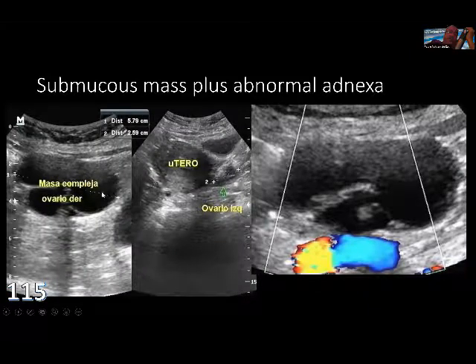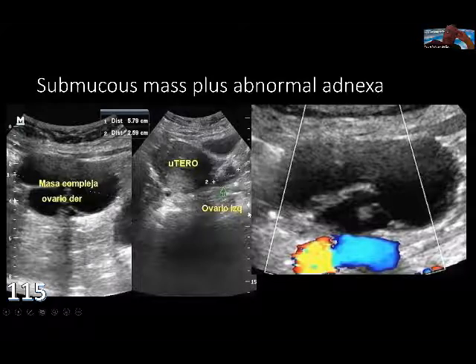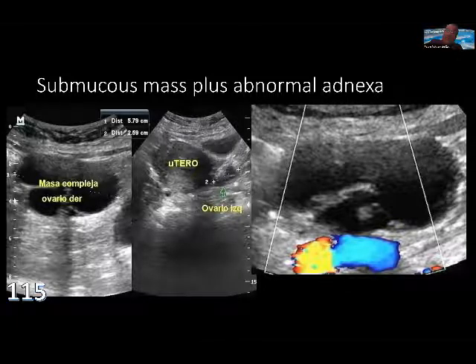And that next thing, I can call it ovarian at first sight, but see this? This is like a sausage which you twist. This is the usual appearance of an inflamed tube doing this. So it probably is not the ovary, but the tube, which becomes like that after infection, surgery.